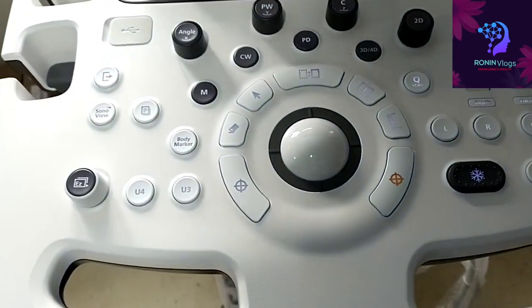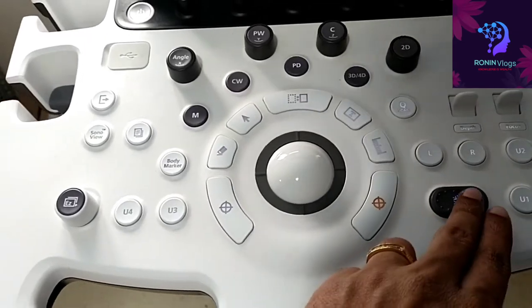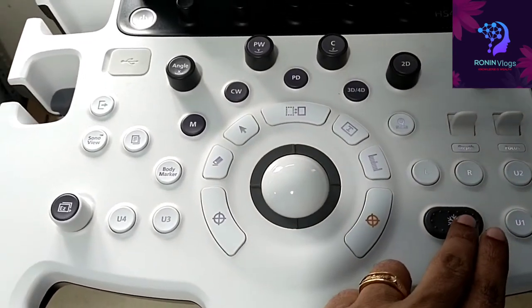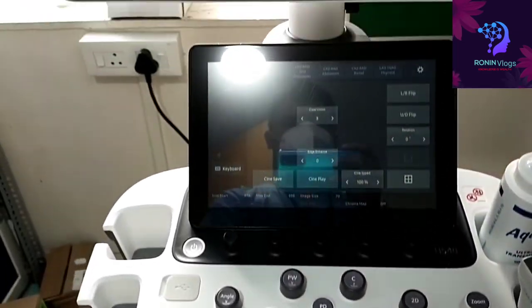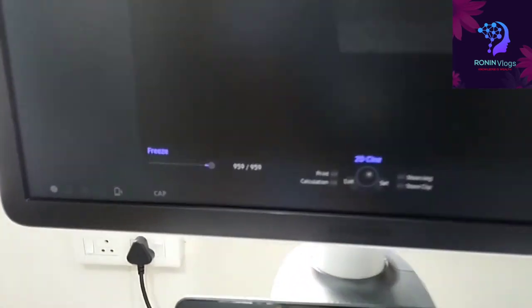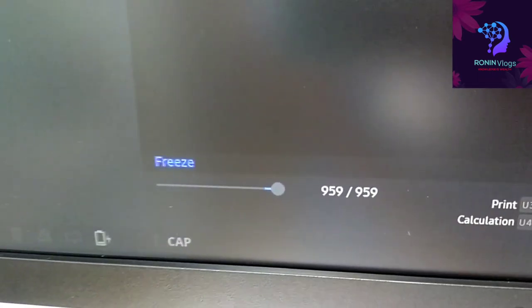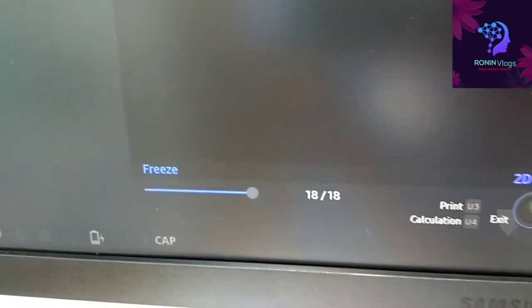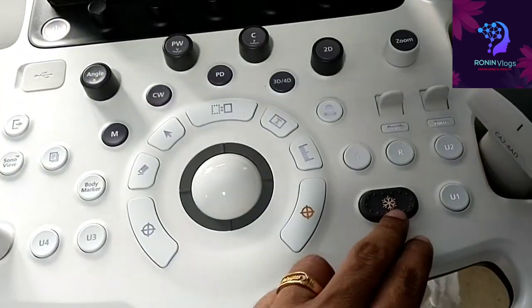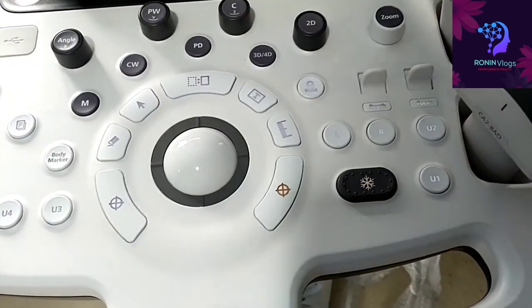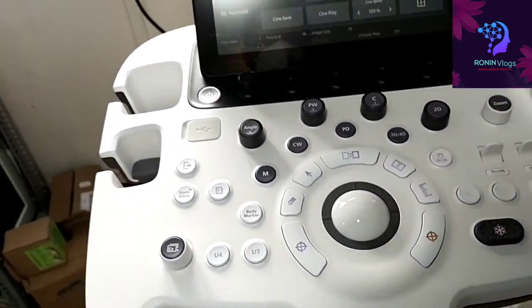Tap the right and we can see two windows. This is the freeze button. If you press the freeze, it will freeze. When it's shutdown time, we need to freeze and then do the shutdown process.